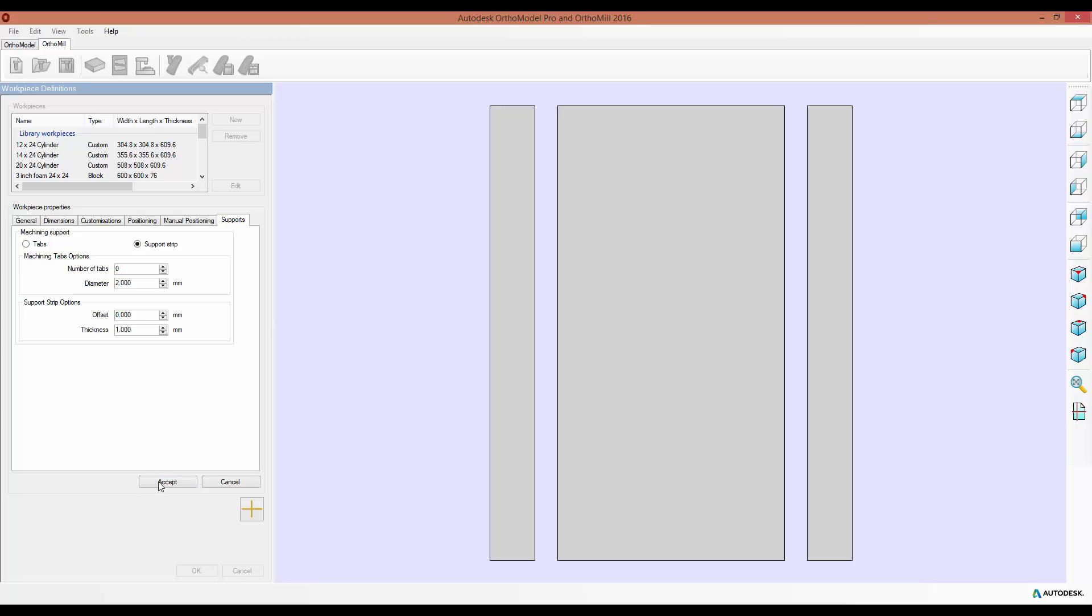And then once you're done, accept everything in the standard way. And this will allow you much more control over your processes, and mean there are fewer things to manually edit each time you create a job.